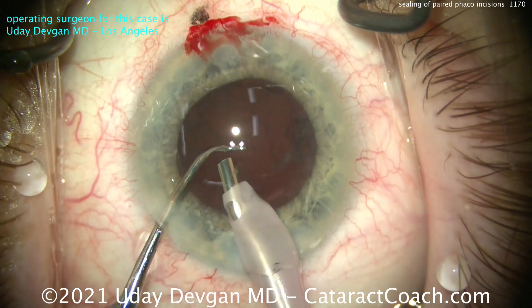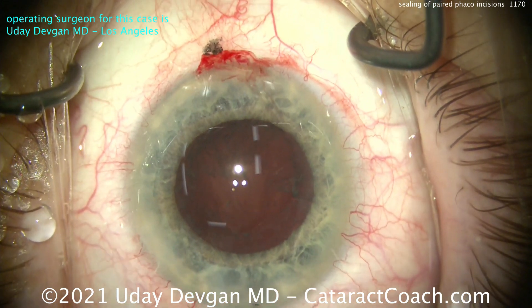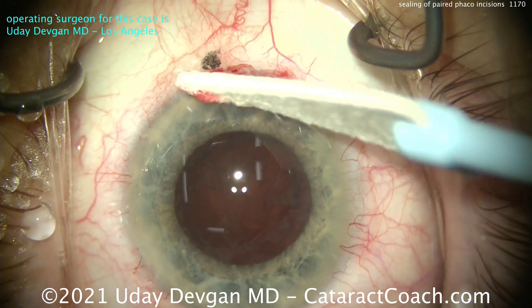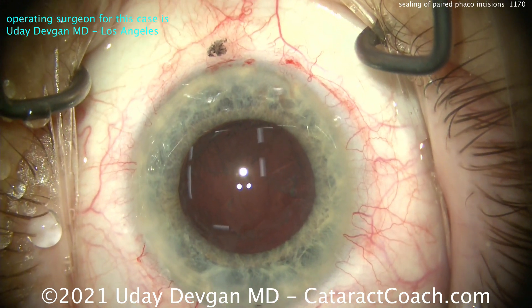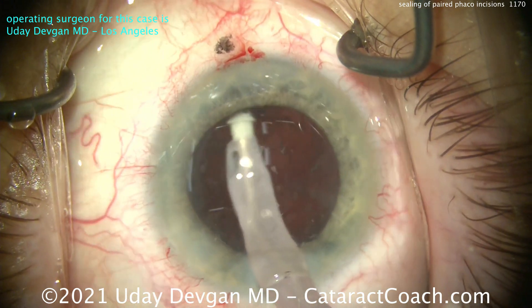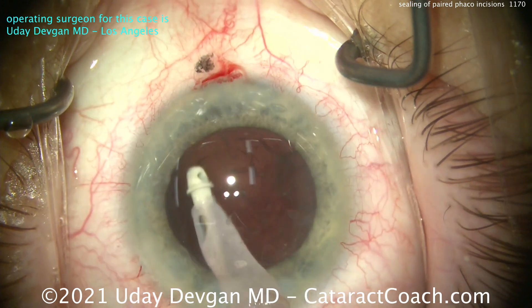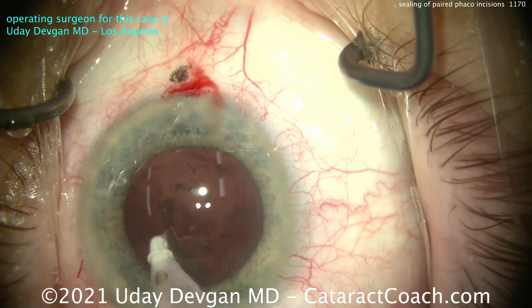The more we use an incision, the little bit rattier the edges get. So the main incision that we use a lot, we'll have to do something with it. But you can see that I touched it with a weck-cel sponge — it's completely watertight. Now going in with the IA probe — again, high pressure, many times higher than normal physiologic pressure.